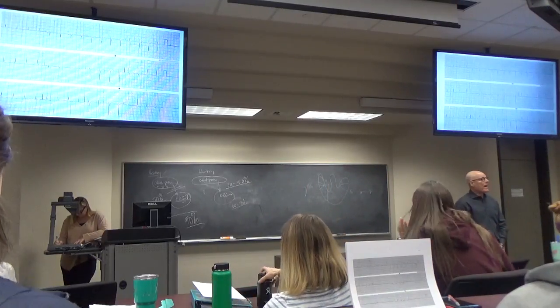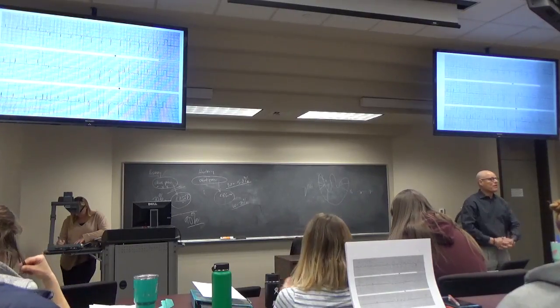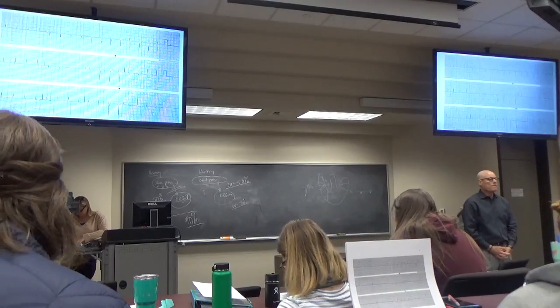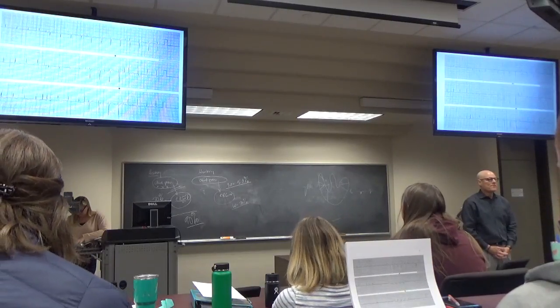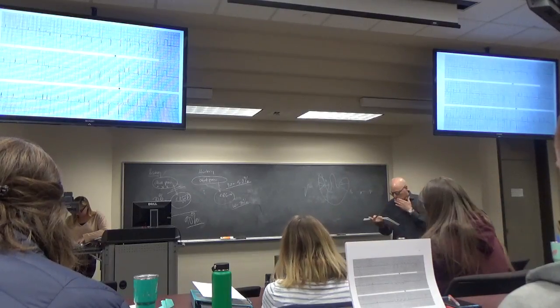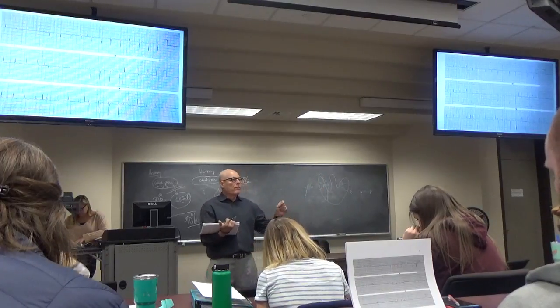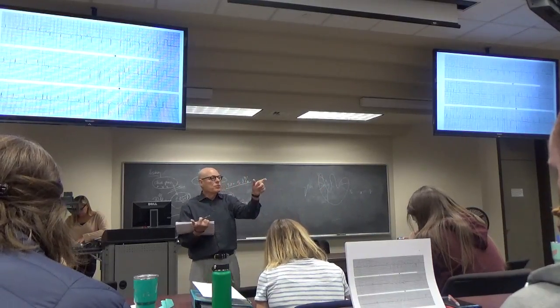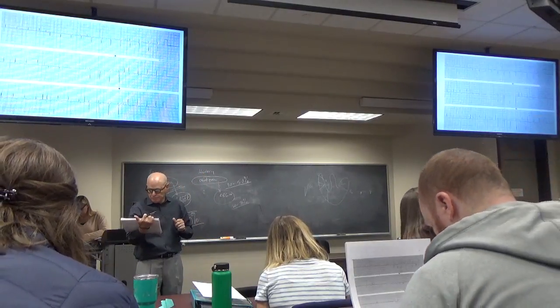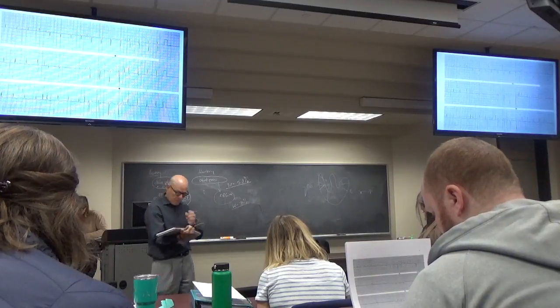in the setting that I had a rabbit in the lab and I was ligaturing off a coronary artery. Now we know that's ischemia, right? This is hard to do. Okay, so it's not that one is greater than the other, but ischemia is subsumed under primary ST-T wave changes. Anything else on this one? 18?